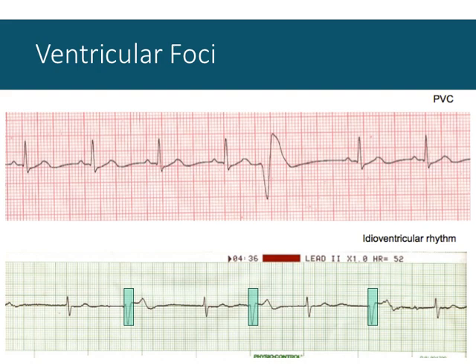So the question is, why would, well actually I'll ask this question in 2 or 3 slides, but start thinking of why the ventricles would fire themselves. There are a few different reasons, and we'll talk about a couple of the ion imbalances that might occur that allow the ventricles to fire. Why might the ventricles fire themselves?